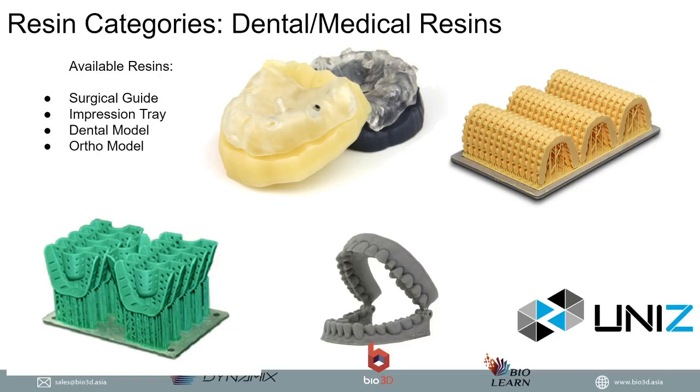Do keep in mind, as with all resins, if you're printing these models for aligners, you must utilize them within the first 2 or 3 days after you've printed them, because any longer than that, they will start to distort ever so slightly.